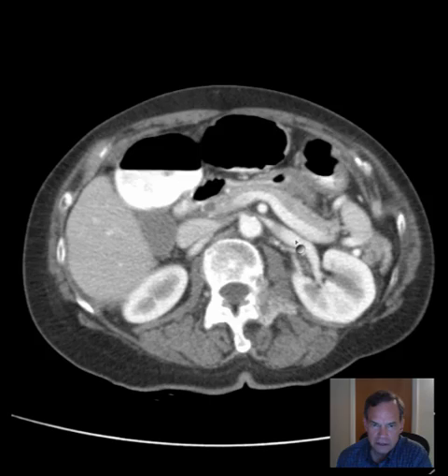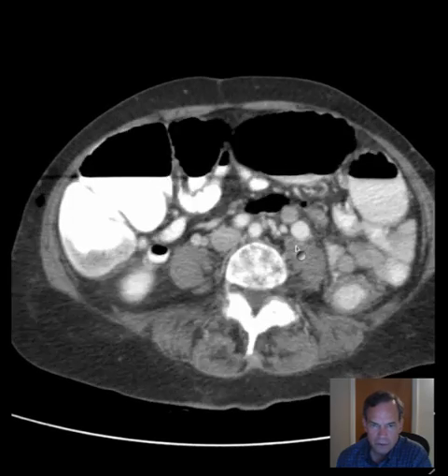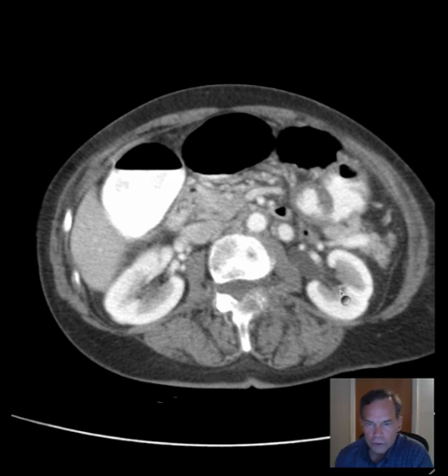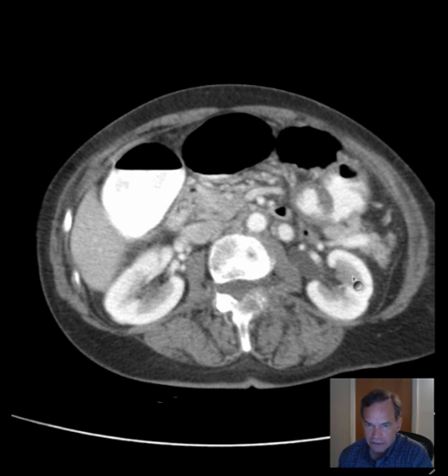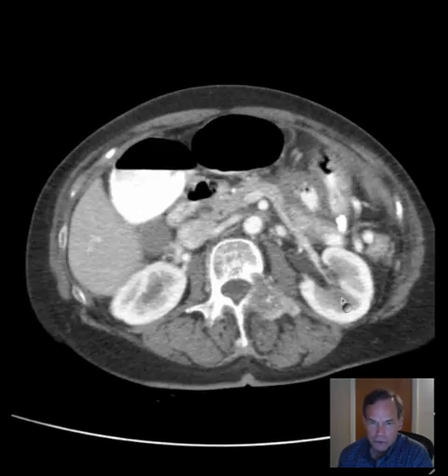Let's see how the kidneys look. They look pretty good — no masses. Fairly symmetric renal enhancement, which is an important finding, because when there's an obstruction there's a delayed nephrogram on the side of obstruction, meaning the degree of enhancement is less on that side. We do not see that asymmetry here.